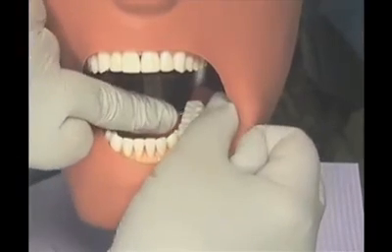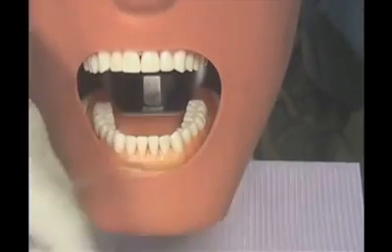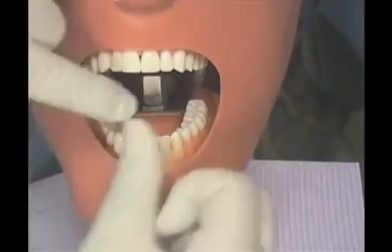Floss all contacts involved in placement of the dental dam. After using a template or stamp, mark on the dam the teeth to be isolated. Correctly punch the marked dam according to the teeth to be isolated. Be sure to use the correct size of punch hole for the specific tooth.